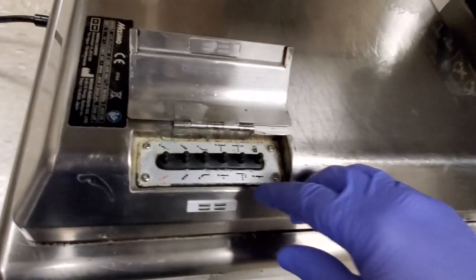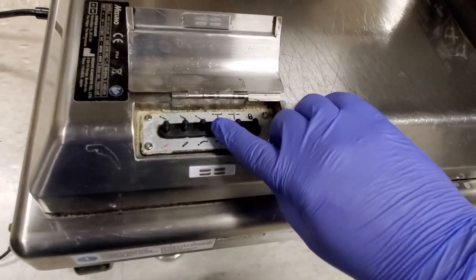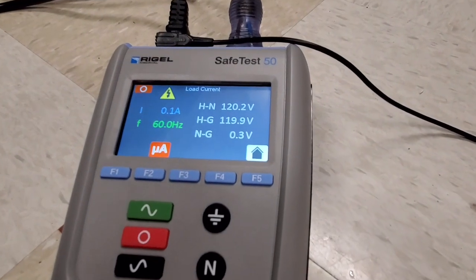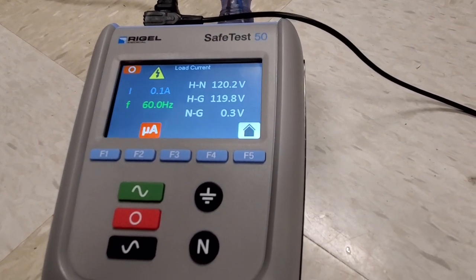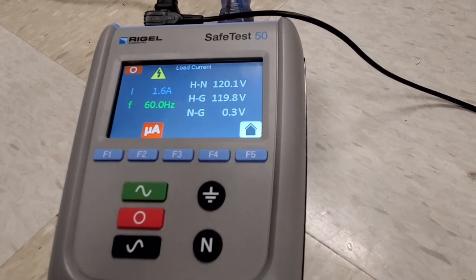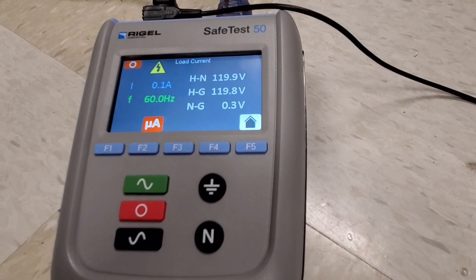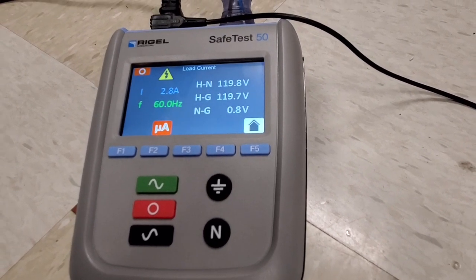Let's get back to where it belongs. Here's the table up button — I'm going to go ahead and activate it. You should see the equipment current jump. There we go: 1.6 amps, 1.5 — that's excellent — 2.8.